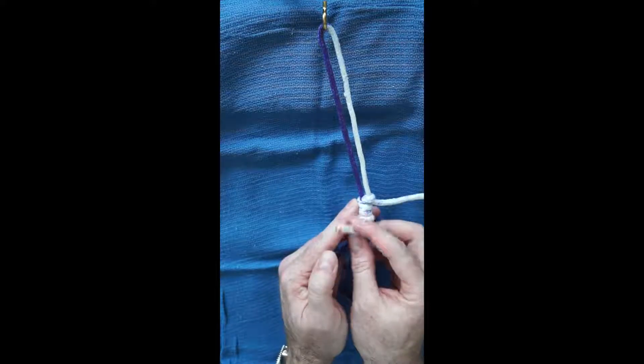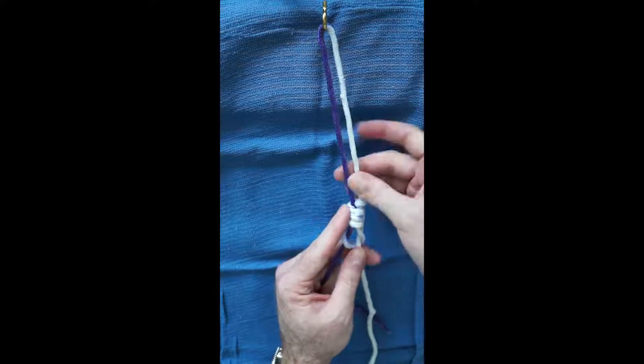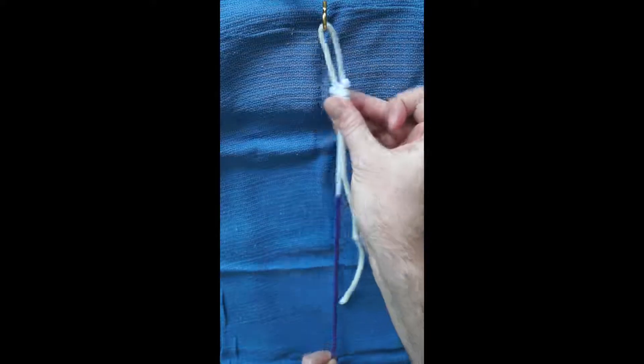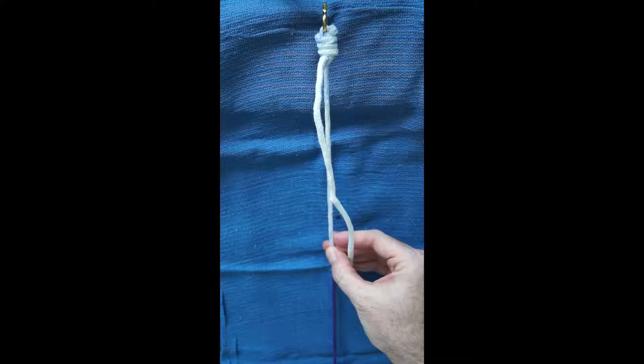Last, the non-post strand is passed up from underneath through the loop created at the thumb in the first step. The knot is then dressed by pulling apart both the post and non-post strands that are closer to the cannula or portal.